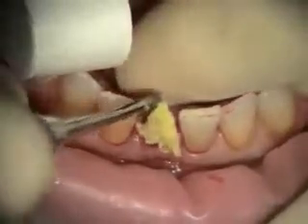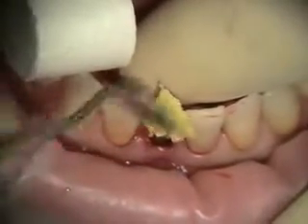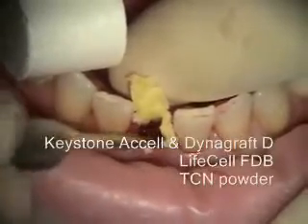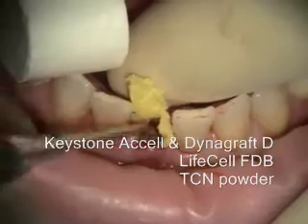We're putting our graft in now. This is a combination of Dynagraph D, a-cell, and mineralized freeze-dried bone.